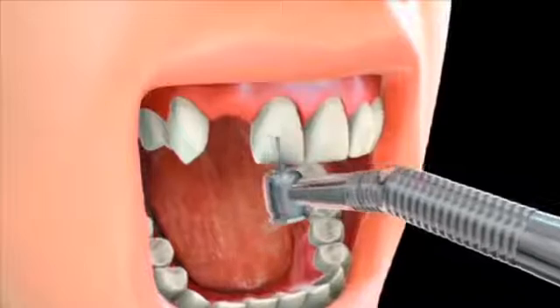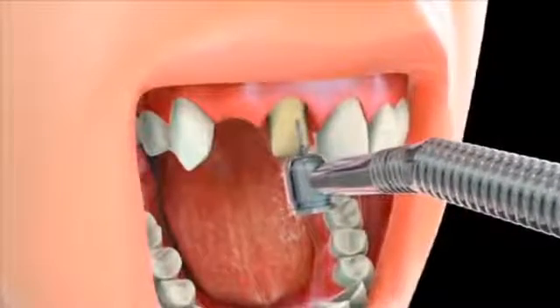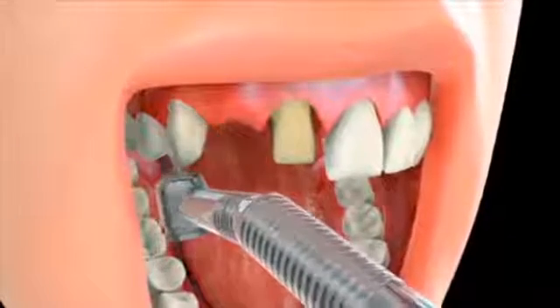During this visit, the supporting teeth, which are typically the ones on either side of the missing tooth, are prepared by shaping and reducing their size. This is done to make room for the crowns that will slide over each of the supporting teeth.